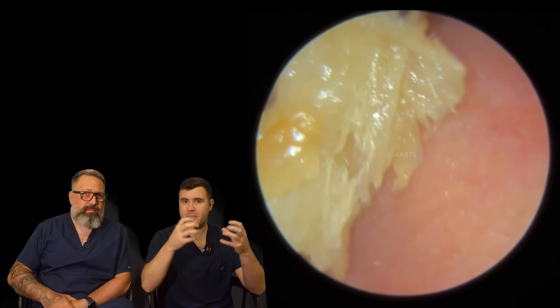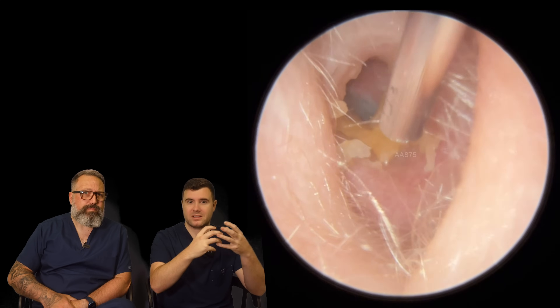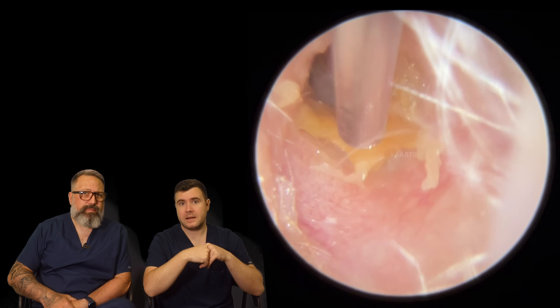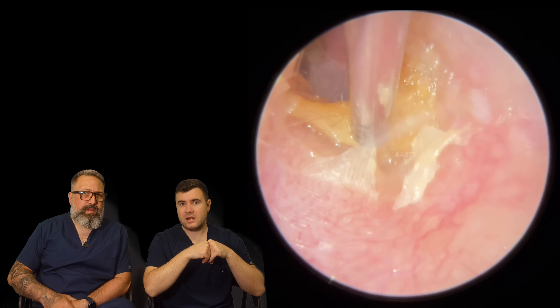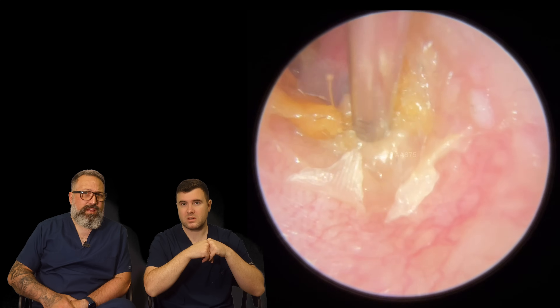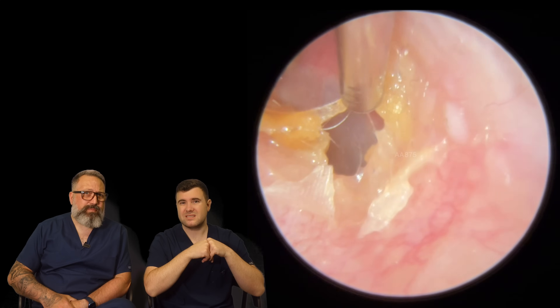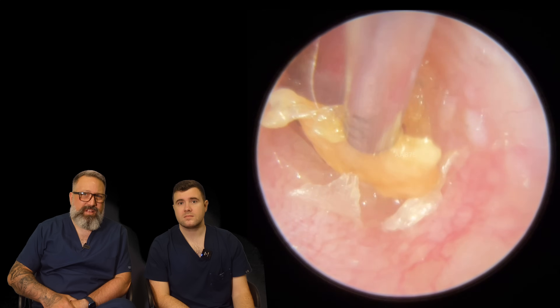the fine end is normally better at holding it all together. I didn't really want it to break apart in case that happened. So that's the reason I've stuck with the fine end here. I didn't really want to put any oil in because that's not really going to make much of a difference with this kind of skin that's holding on. You can see how wet that is already — adding more oil to that, well, I don't think it would have made much of a difference.